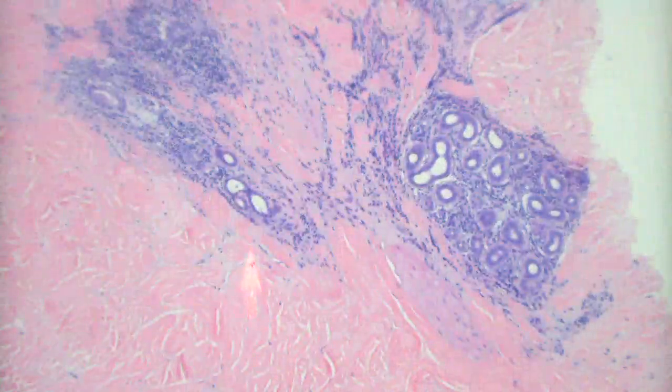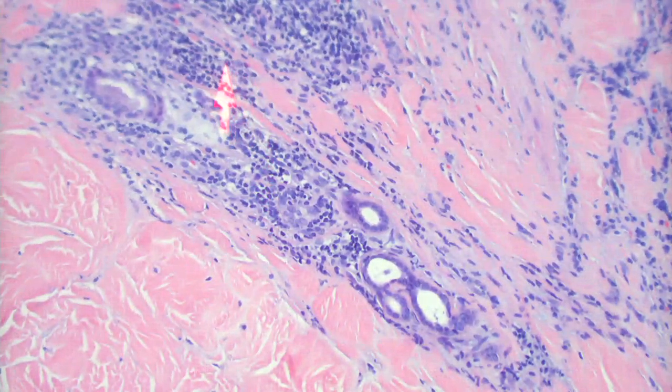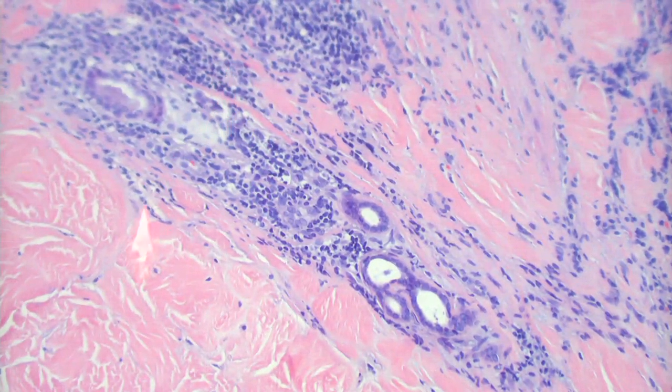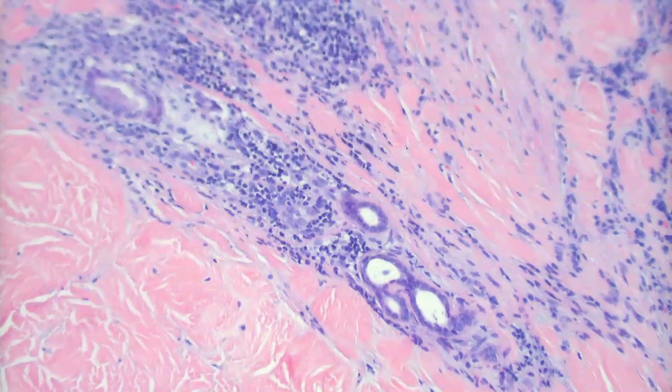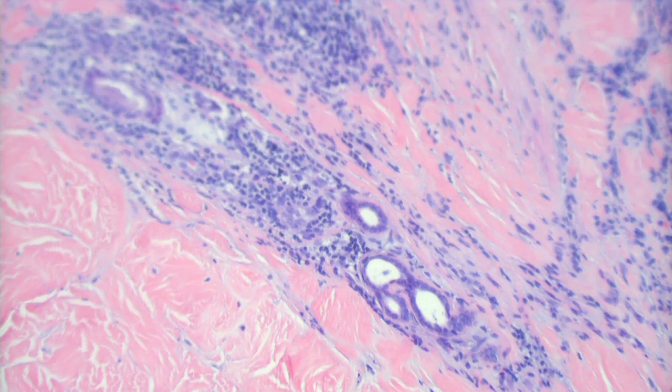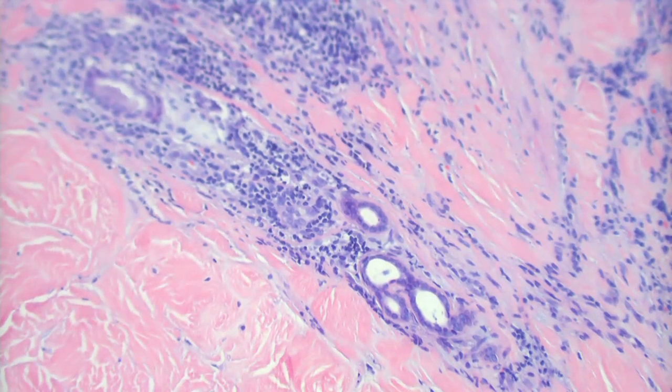And I personally think there's probably some pathophysiologic reason for that. I don't think that's just for fun. I don't think we've figured it out yet. If somehow we do figure out why these are here, maybe we can treat this in some way. I think somehow that's related. Every single sclerotic condition in the skin has some plasma cells in it at some point: NLD, sclerotic GVHD, sclerotic PCT, sclerodermatomyositis.